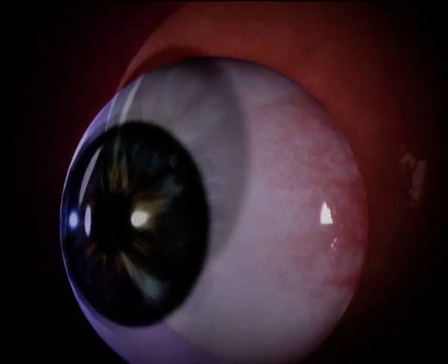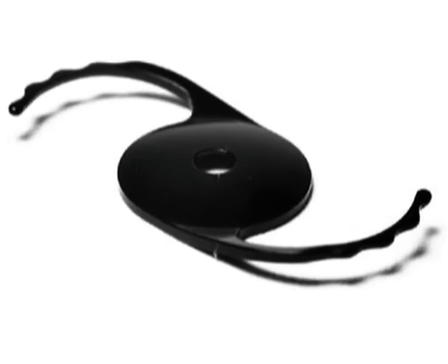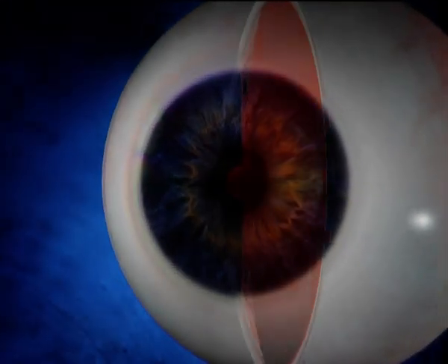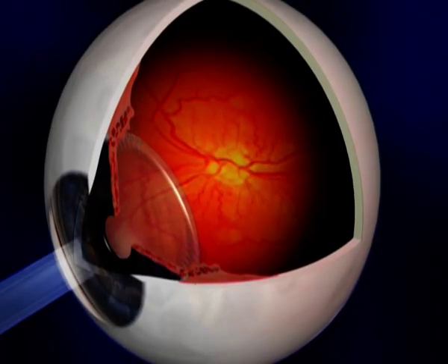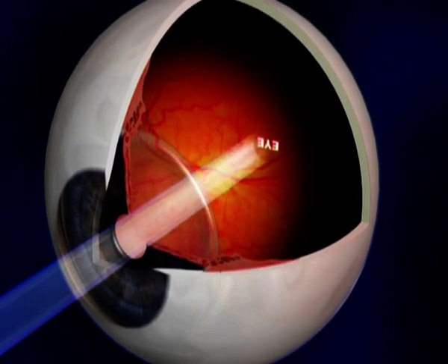The principle of small aperture optics has been placed at the level of cornea and at the level of the lens to correct presbyopia by enhancing the depth of focus. A similar principle, when applied at the level of iris and pupil, works efficiently by filtering the defocused rays emanating from the irregular peripheral cornea and increasing the visual potential.